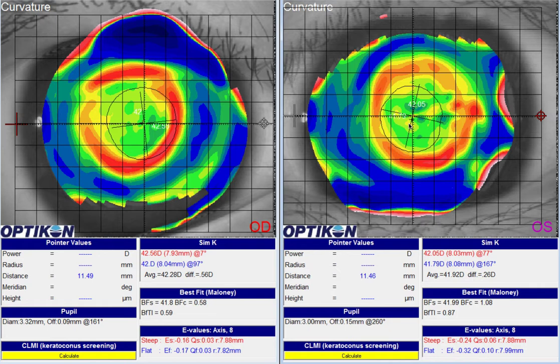So in a case like this, what I would plan or recommend doing is increasing the overall diameter of the lens. I think we're at a 10.8 right now, and on this cornea, I think we can pretty easily go up to an 11.2, and then increase the sagittal depth of the lens. There's also some central corneal insult that's being seen after the patient wears lenses. I think there's just too much central bearing, and the pore seal out in the periphery, as the lens kind of teeters on the apex of the cornea, is also contributing to the undercorrection.